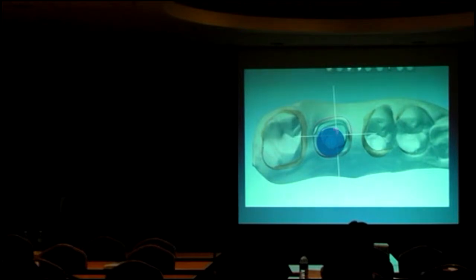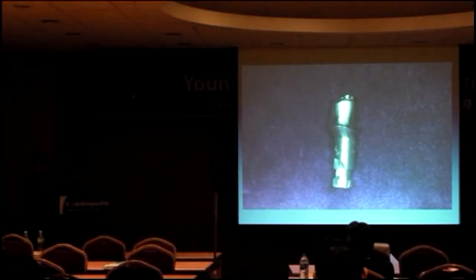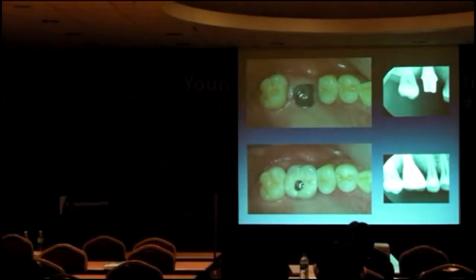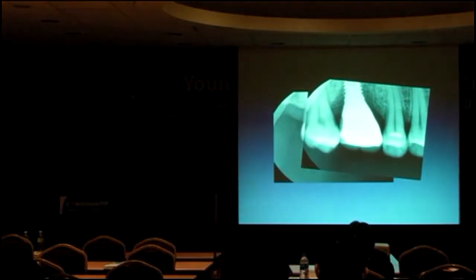So I control the distance from the center, and I asked the company to fabricate the abutment that I designed. This is how it looks after fabrication and final restoration. Then I tried it in the patient's mouth. I haven't used any impression material for this patient. We only used the data, and the model fabricated from CAD/CAM was used.